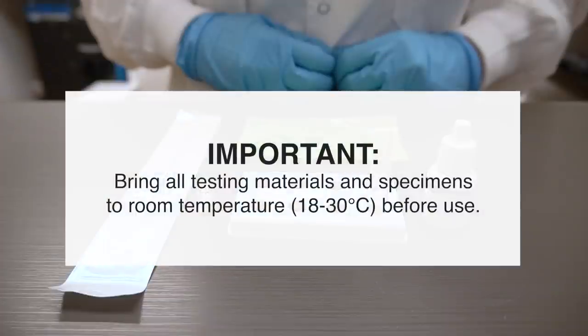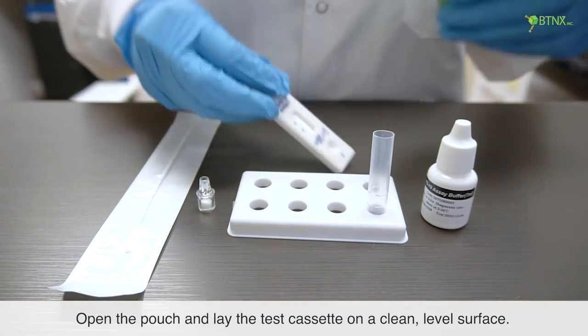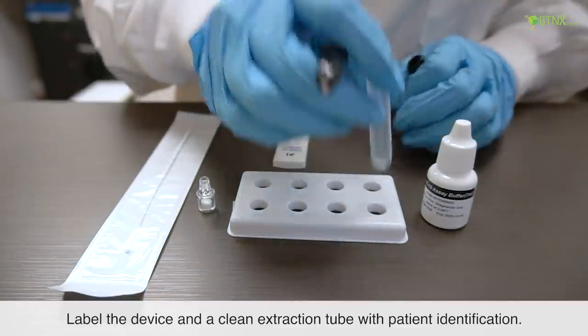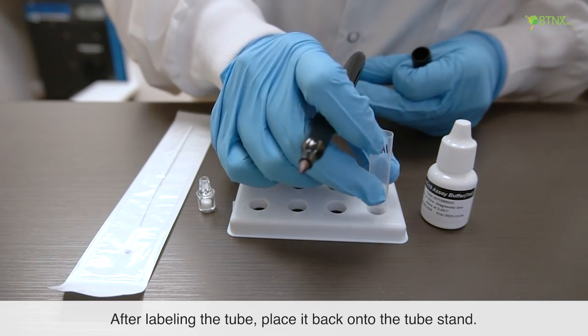Bring all testing materials and specimens to room temperature before use. Open the pouch and lay the test cassette on a clean, level surface. Label the device and a clean extraction tube with patient identification. After labeling the tube, place it back onto the tube stand.